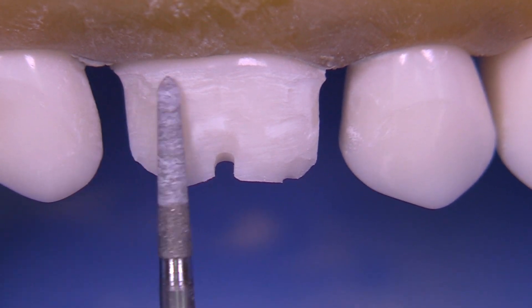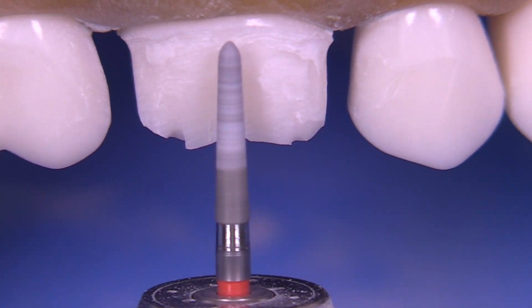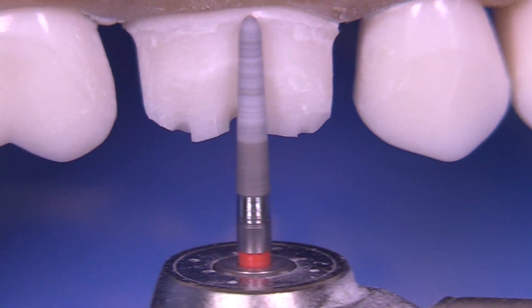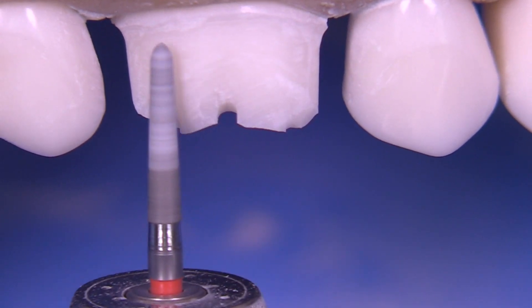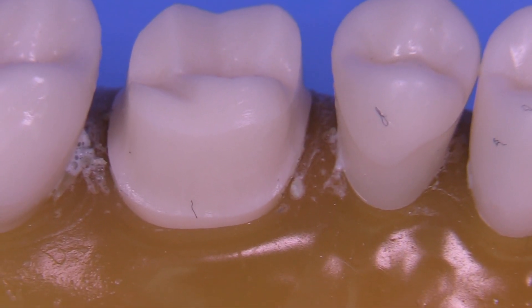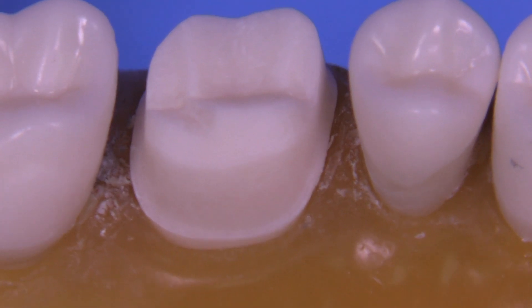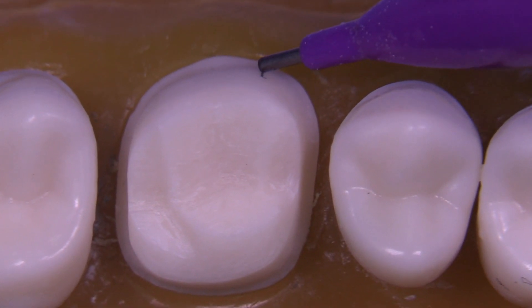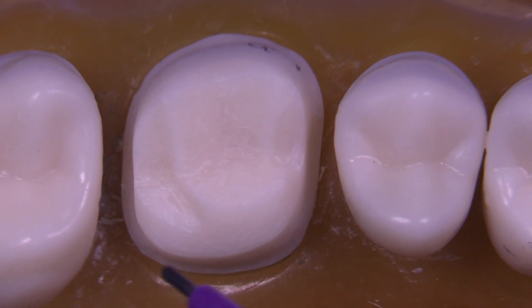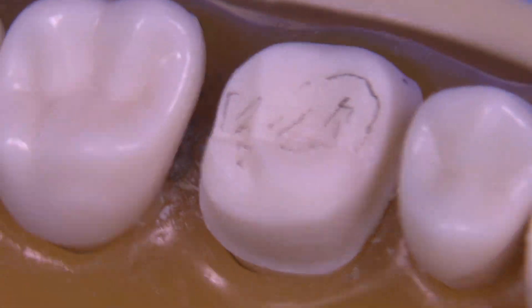We're just trying to establish the right contour in that upper portion. It's really key that no matter where you are in the preparation, you're always thinking: what is it that I'm trying to accomplish at this moment? Why am I holding the bur the way I'm holding it? Is it because I'm trying to get a deeper axial wall and maintain retention? Is it because my axial wall is deep enough but over-tapered and I need to upright the bur? Or am I focusing on the contour zone — that secondary plane on the facial and lingual? Take a good look at your prep and see where you need modifications: uniformity, shallow areas, potential undercuts, rough areas on the occlusal — set your goal and execute.